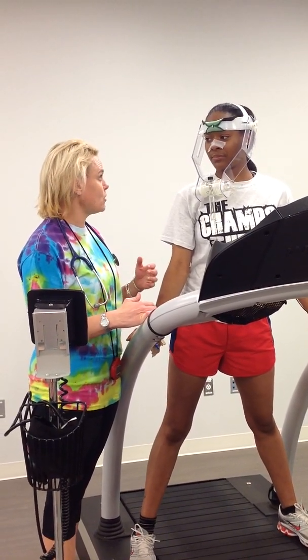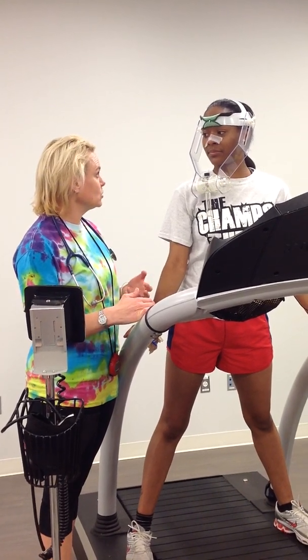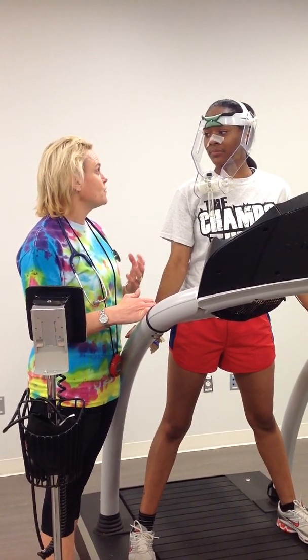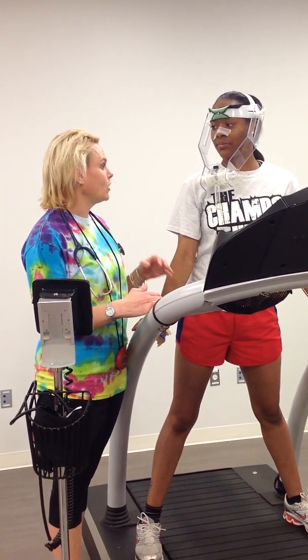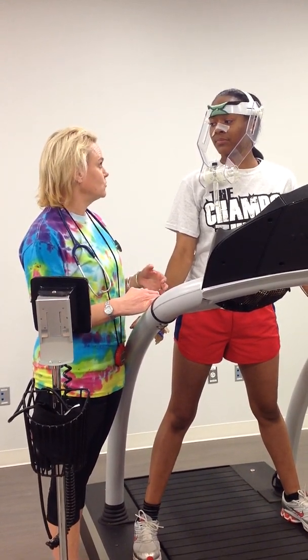The test is going to start off fairly slow, but every three minutes the speed and the grade are going to get more difficult. At the end of the test, we want you to be at the point where you don't have anything left in you.